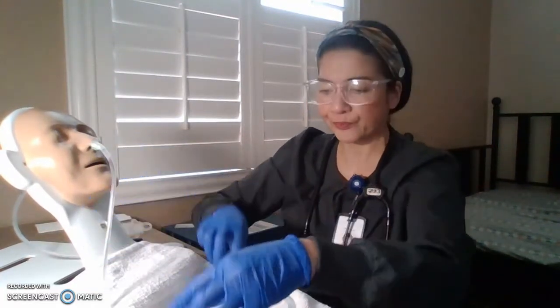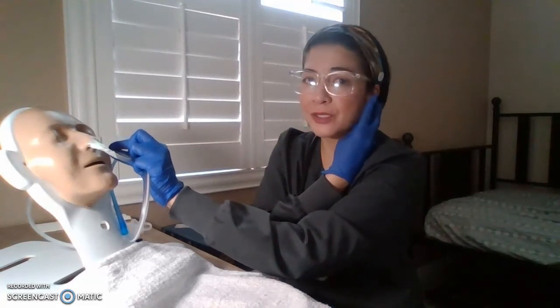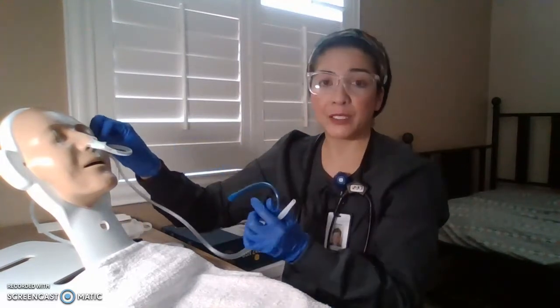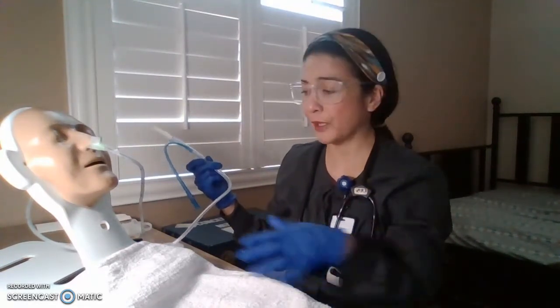Okay, make sure. And some would tape it over here too. Use a transparent tape to see the tissue integrity as well as days go by. At least you would see. Some tape it over here at the cheek area. And now this part, just move it away from the patient. Make sure they're comfortable and it's not in their way. So you tape it or you secure it with a safety pin on their gown.